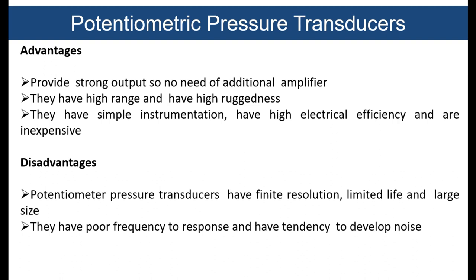And there is very high electrical efficiency, because we are just determining the change in resistance as pressure is applied. So it's not a big deal to understand the concept of using this potentiometric transducer, and there is no need for high electricity, just the application of pressure is required. Due to the very limited use of electrical components, the running cost is very low and it is not so expensive.